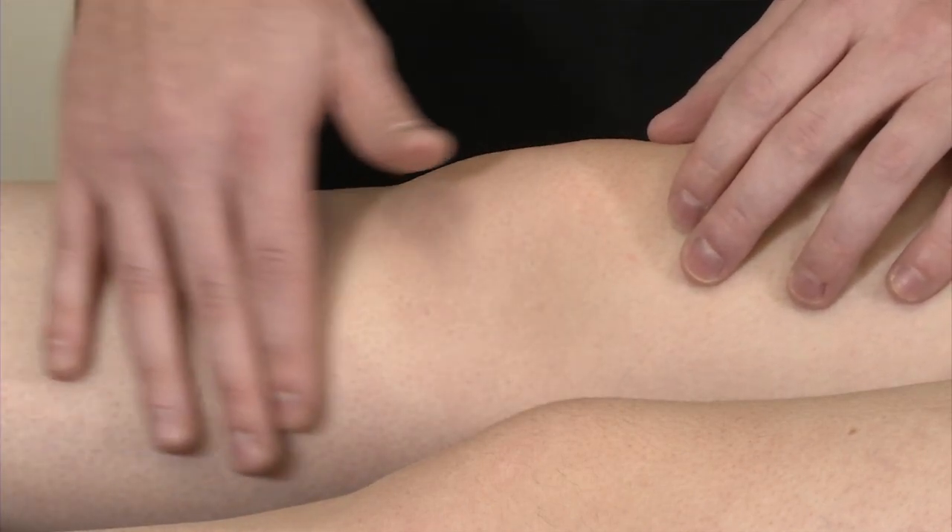At that point, you can then withdraw your syringe, clean off the skin, and put a sterile bandage on. And that's your medial retropatellar approach for knee injection.